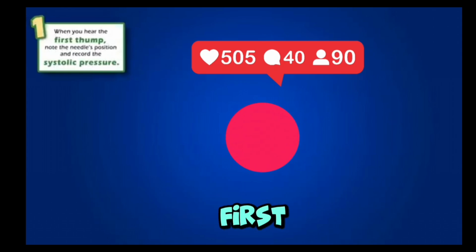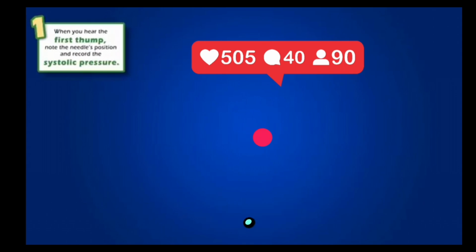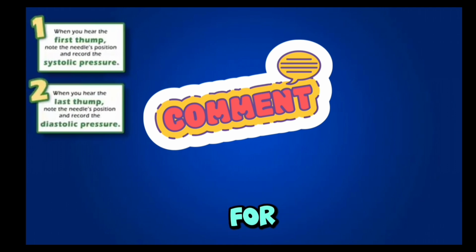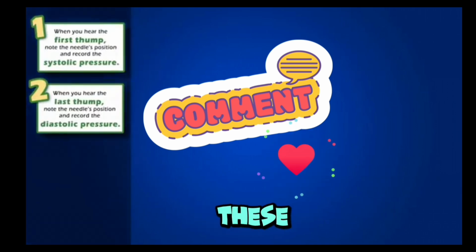Upon hearing the first thump, note the needle's position on the dial and record the number. That's the systolic pressure. As the cuff deflates and the needle continues to move, you will continue to hear the thumping sounds. Listen closely for the last thump. Upon hearing the last thump, note the needle's position on the dial. That's the diastolic pressure.